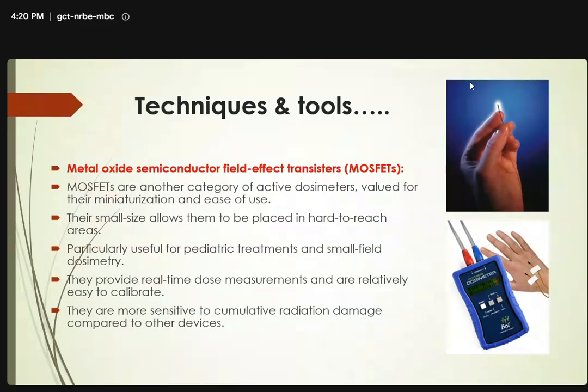Next is MOSFET, the metal oxide semiconductor field effect transistors. MOSFETs are another category of active dosimeters and valued for their miniaturization and ease of use.